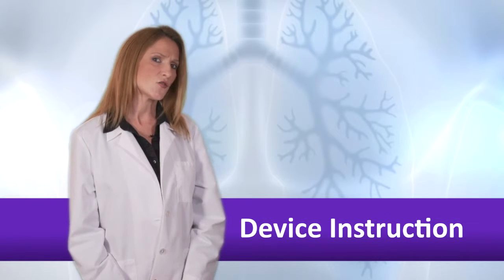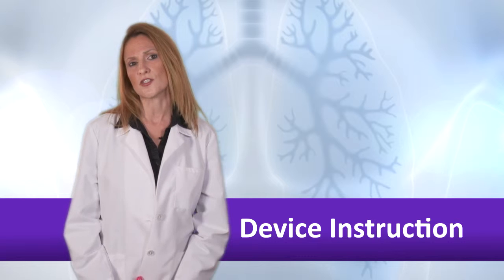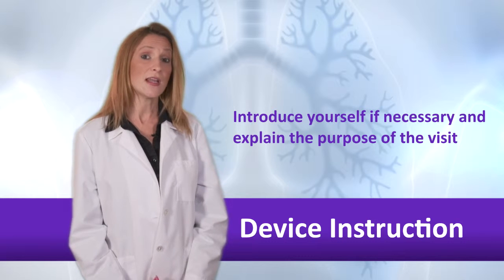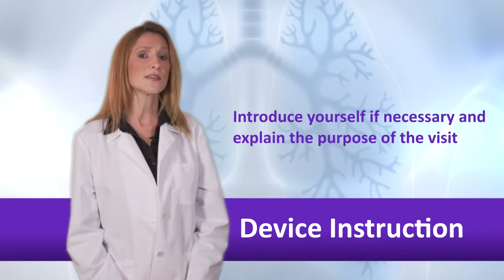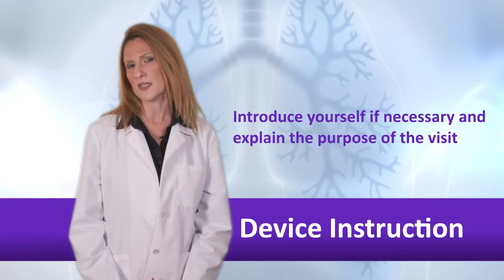Step 2, device instruction. Presuming the patient is new to the device, the actual instruction includes several steps. Introduction and purpose. Introduce yourself if necessary and explain the purpose of the visit. I find that taking a moment to add an additional comment about the importance of device technique is useful to set up this and future follow-up sessions.